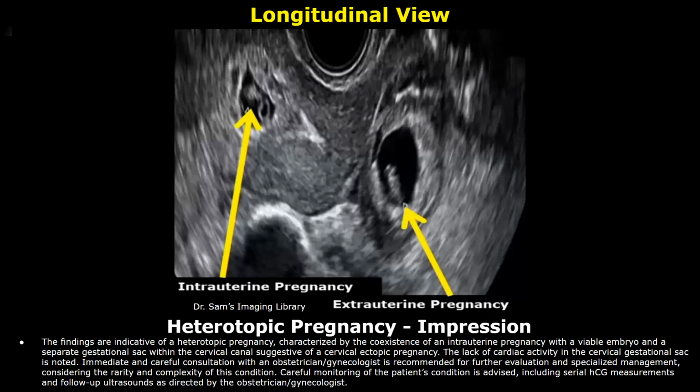Immediate and careful consultation with an obstetrician or gynecologist is recommended for further evaluation and specialized management. Considering the rarity and complexity of this condition, careful monitoring of the patient's condition is advised, including serial HCG measurements and follow-up ultrasounds as directed by the obstetrician or gynecologist.